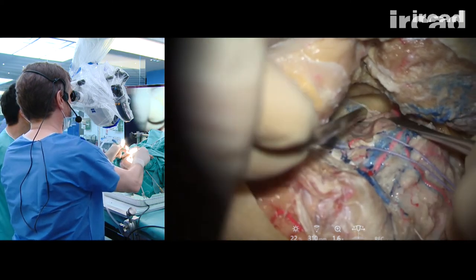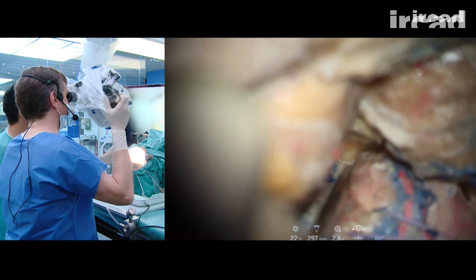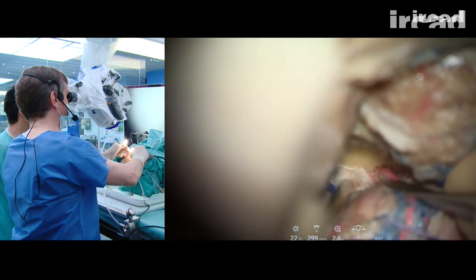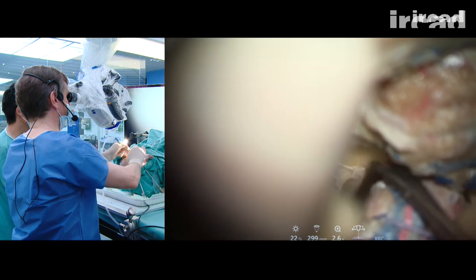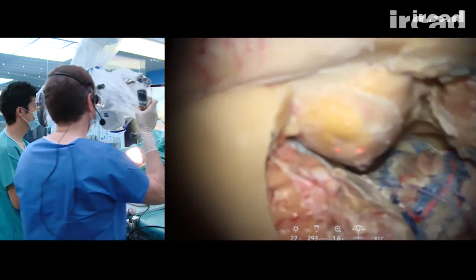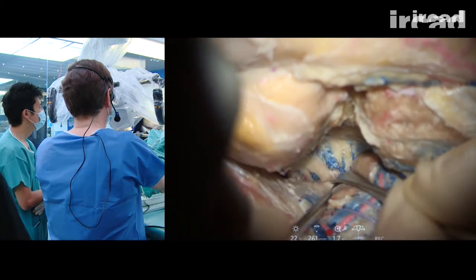When you do that, you have always to remember that there is brain behind the dura. So retraction should be careful. Here the brain is very stiff, but gentle movement. This is V3. This is middle meningeal artery and foramen spinosum. So we have the full cavernous sinus.